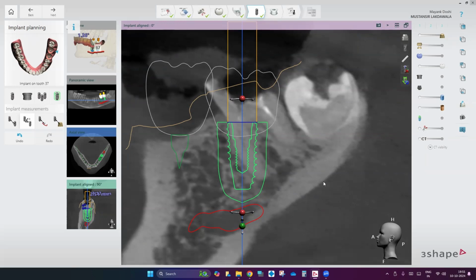So were you there when we were adjusting the arc of it? Yes, sir. Okay, perfect. Because I remember specifically you asking, but I've never had the need. So honestly speaking, this is the first time I also adjusted that.